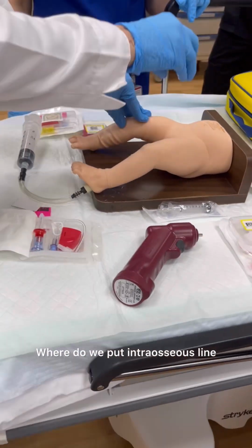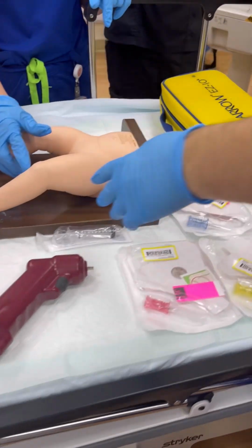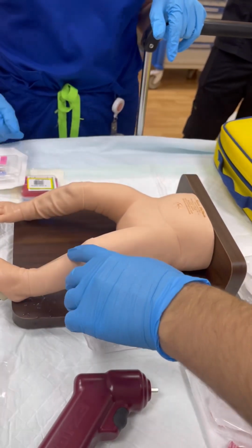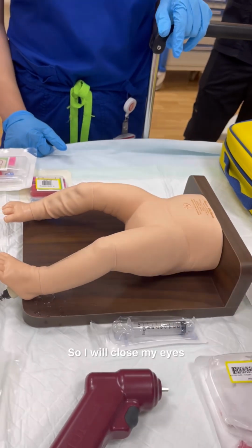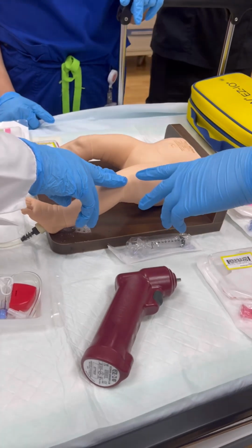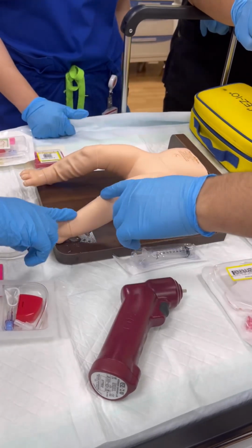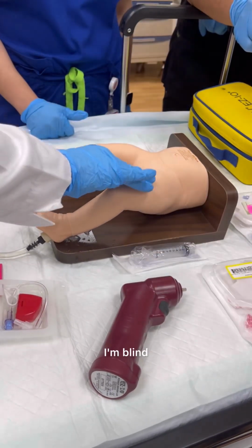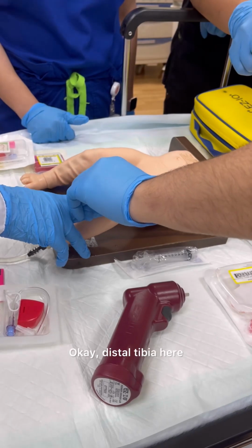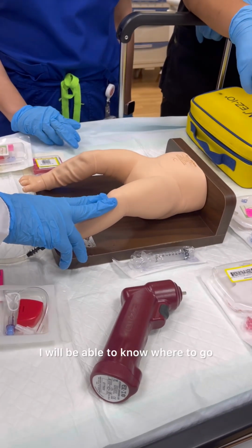Where do we put an intraosseous line? Most commonly in the proximal tibia. No, this is distal tibia, proximal tibia. I will close my eyes, and you will tell me where I have to go. Direct me first. Proximal tibia, where? Don't direct me by pointing. I'm blind, so you need to direct me by your instructions. If your instructions are good, I will be able to know where to go.